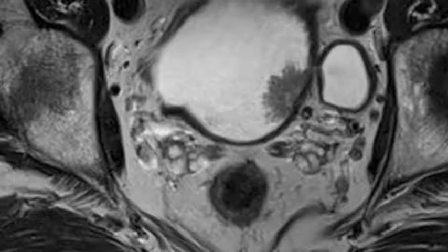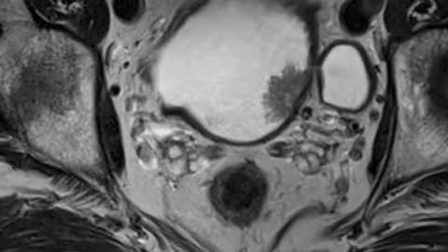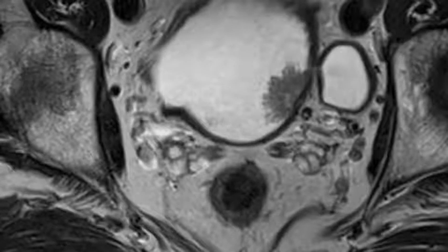On the late, more than 5-minute post-contrast T1 weighted image, urine has high signal intensity and the intraluminal portion of the bladder tumor is clearly depicted, although small bladder wall tumors are obscured.